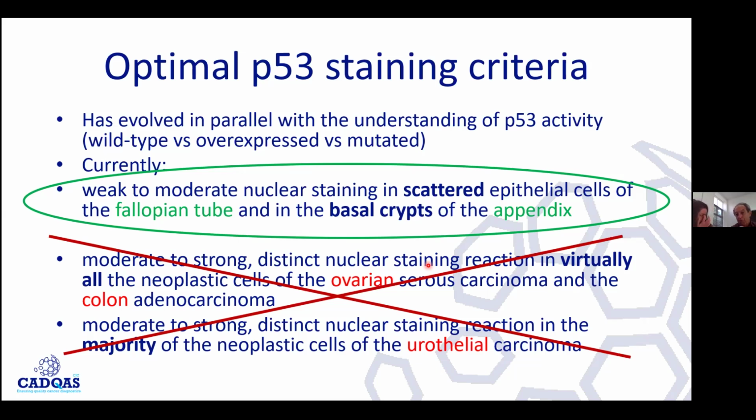Maybe these providers of cell blocks, cell lines for on-slide control, may think about providing cell lines with specific mutations, and then you can have an array of these mutations with a different antibody, and you know what mutations you're looking at.